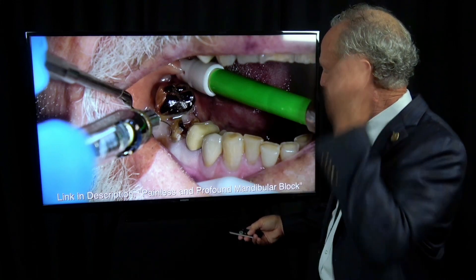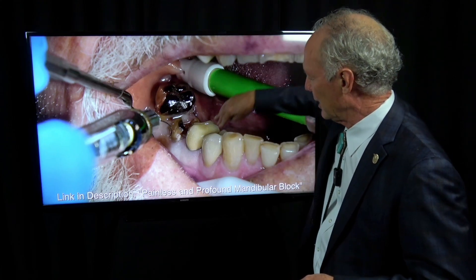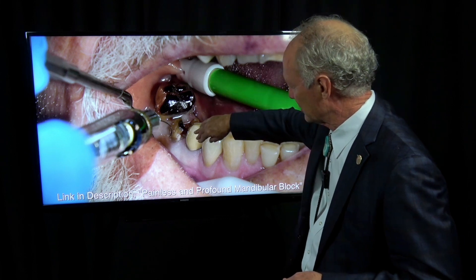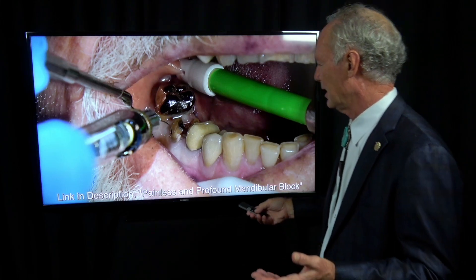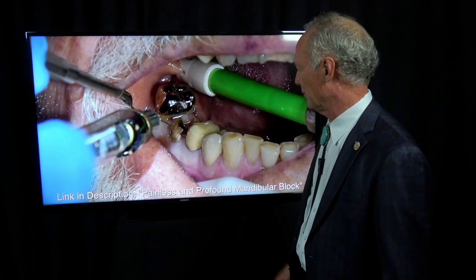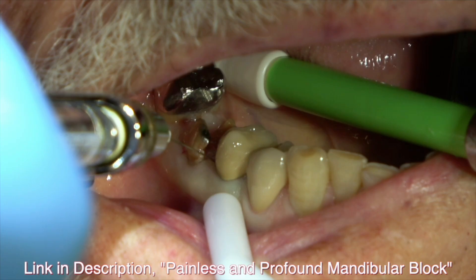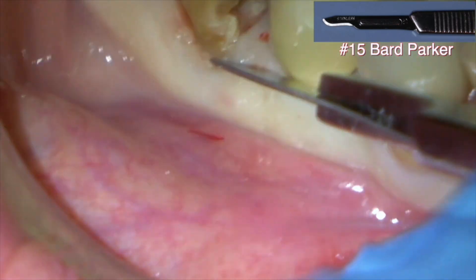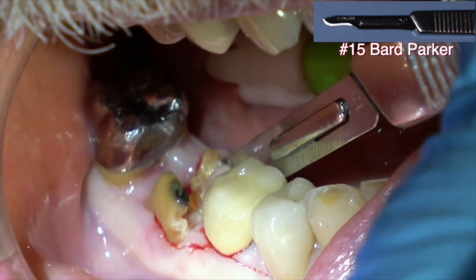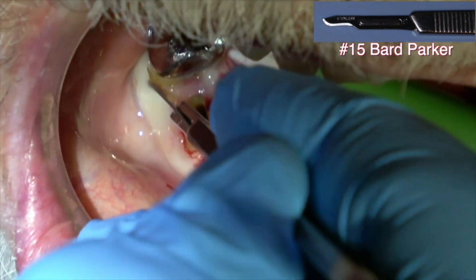You have to give an intraligamental injection. Use a 30 gauge needle — you can also use a 27 — turn the bevel toward the tooth into the sulcus after you've given the block, and just apply steady pressure for a count of about 30. I may give it at several points because especially if you've got an apprehensive patient, if they feel the injection, it's going to be like a skittish horse that you just throw a saddle on — you've lost the moment. If you can start out with no pain and they never feel any pain, you are off to the races.